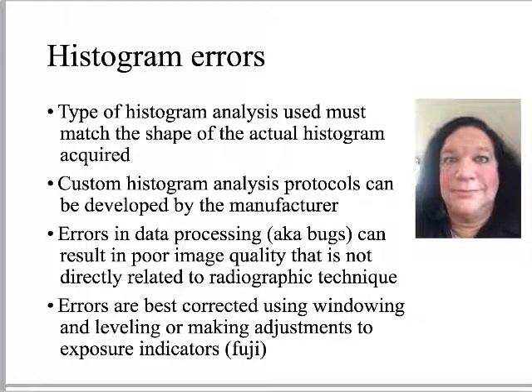No amount of adjusting contrast or density was going to fix that, right? No amount of trying to change the Joker's makeup into a wedding day makeup job is going to fix that, right? We need to go all the way back to zero, take off all that Joker makeup, and start with the foundation and rebuild the entire thing. We have to redefine the whole volume of interest.